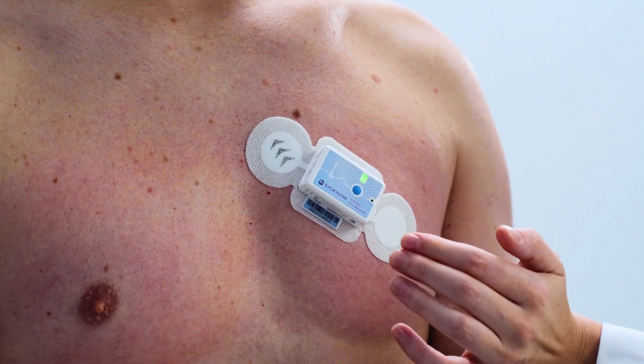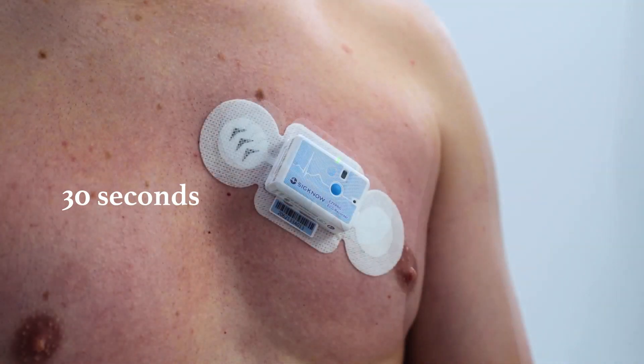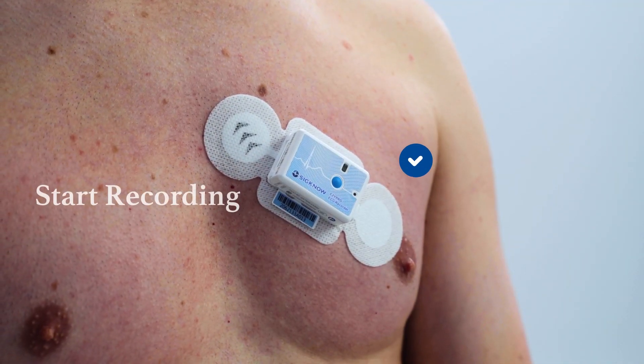Press the blue button to activate EasyPro. A green light will show for 30 seconds. Once the green light goes off, the recording starts.